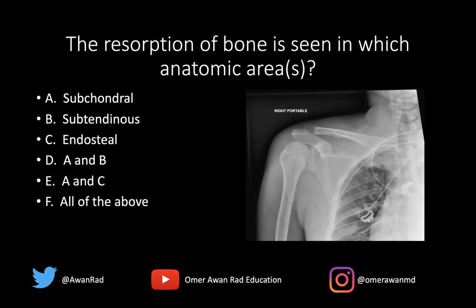If we take a look here, we notice that there's resorption of bone along the distal clavicle — distal clavicular osteolysis. We can see that it almost looks like a rat has eaten out a piece of that bone along the distal clavicle. This would be subchondral because this is at the level of a joint, the acromioclavicular joint. But that's not where it ends. If you look along the medial aspect of the humeral head at the glenohumeral joint, there's also an area of resorptive change — also subchondral. So we have two examples of subchondral resorption here.